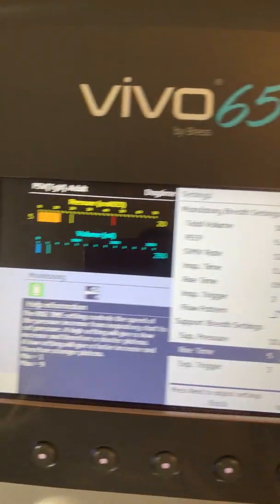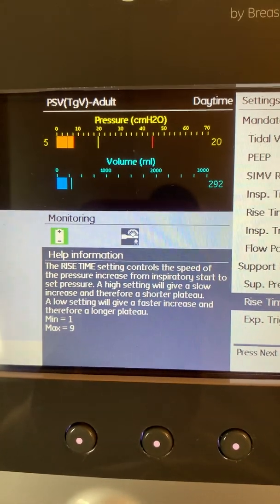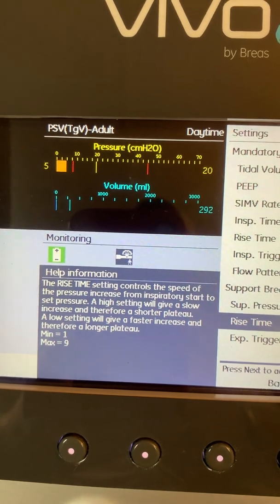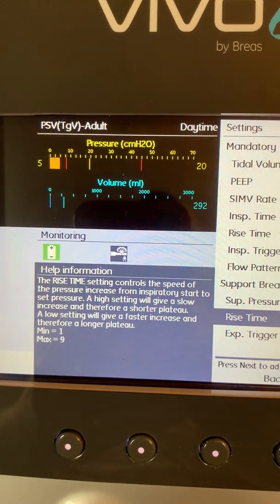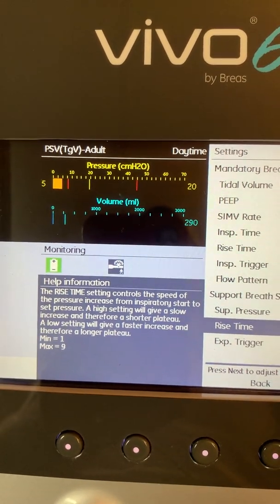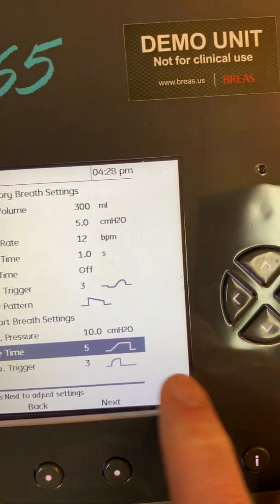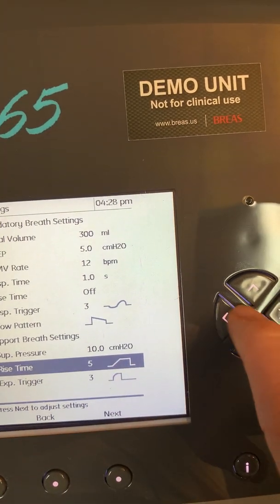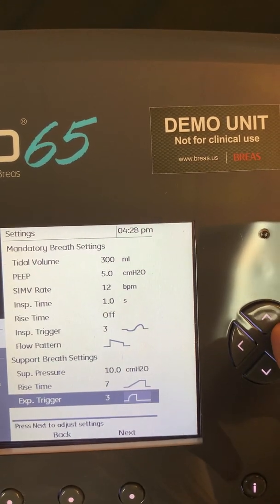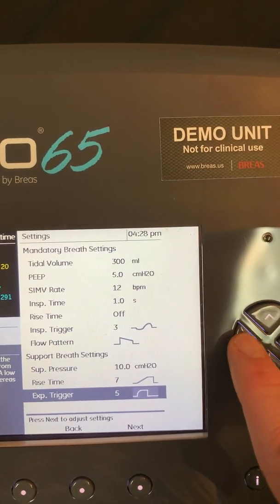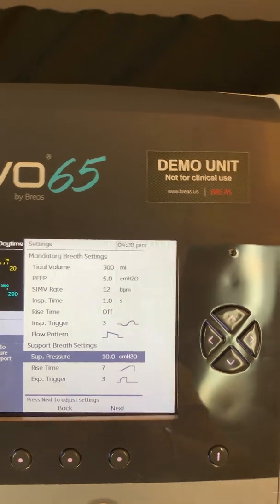If I press that I button, over here on the left-hand side of the monitoring screen you'll see that I've got some help information. This is going to give me a definition of what rise time means. The rise time setting controls the speed of the pressure increase from inspiratory start to the set pressure. A high setting is going to give a slow increase and therefore a shorter plateau, and the low setting is going to give a faster increase and therefore a larger plateau. They've also provided a visual so you can see how you're affecting rise time or the expiratory trigger.